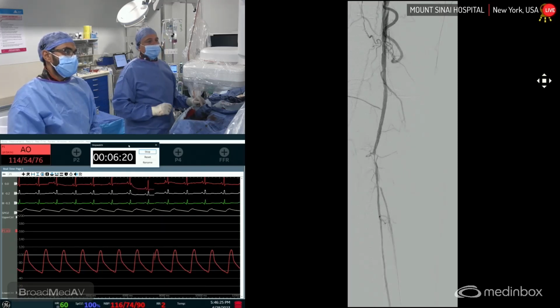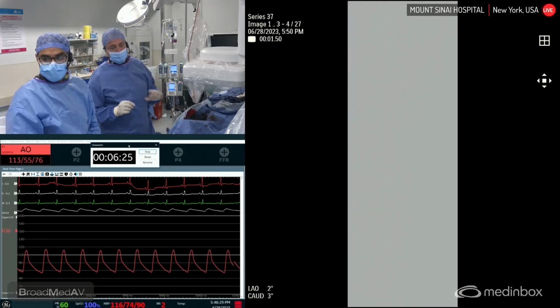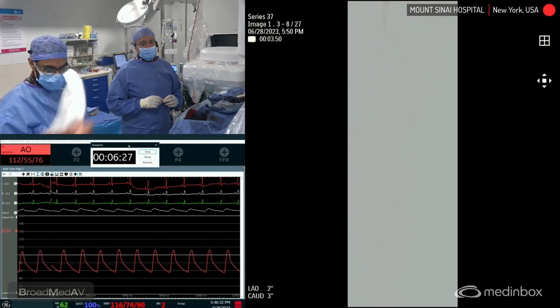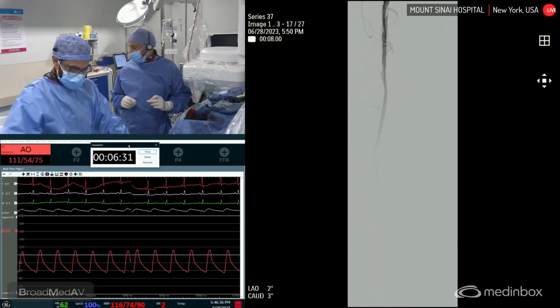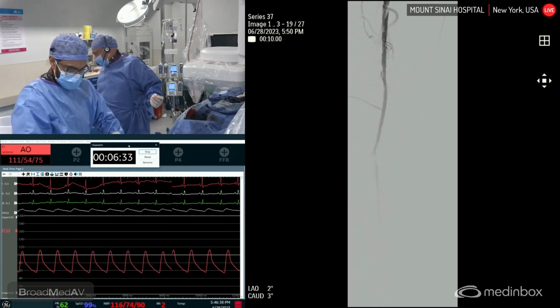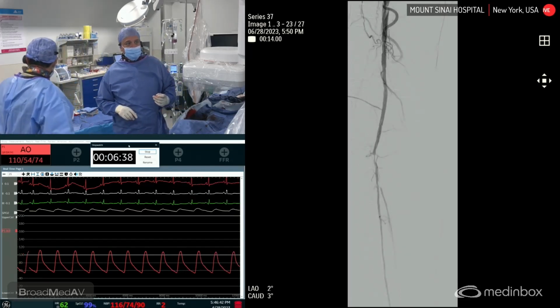The issue here is, do you balloon it? Well, you have high restenosis rates. Do you put a DES? Do you do an atherectomy balloon? I think at this stage we don't have enough data to suggest what to do. I'm probably going to get criticized for this, but let's retrieve the filter, and I don't think I'm going to do anything here.